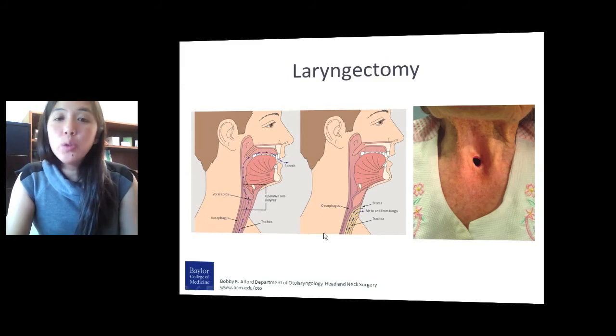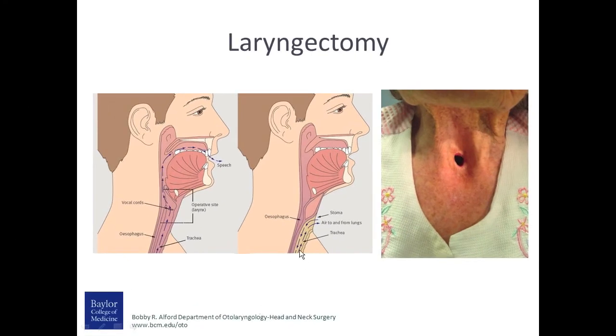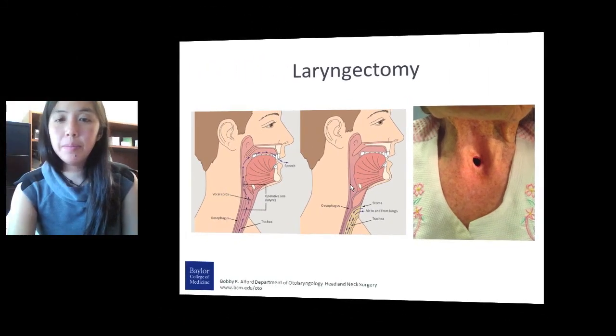Finally, the last way is called a tracheoesophageal puncture, where we surgically make a hole between the trachea and the esophagus and place a little prosthesis through here, a little piece of plastic tube. Patient inhales, and then on exhalation, they cover their stoma. The air is passed through the little tube we placed here, passes up through the pharynx, which then vibrates, and again, they shape that vibration into speech using their tongue, palate, and pharynx. So that's how you rehabilitate speech with a laryngectomy.